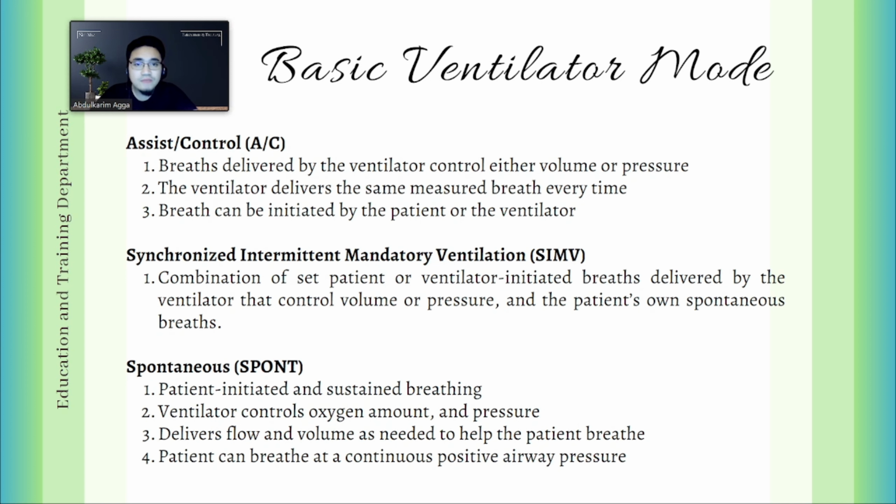So for your SIMV mode, the ventilator will synchronize the air or oxygen being delivered with the spontaneous breaths of your patient. More of a 50-50 scenario.